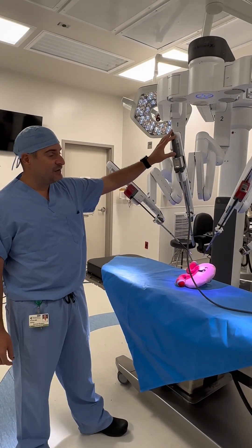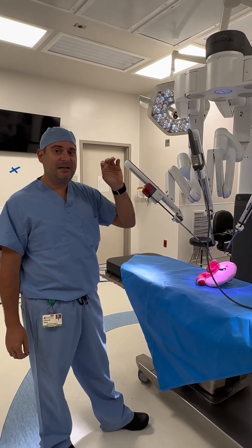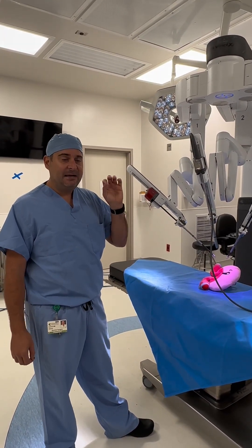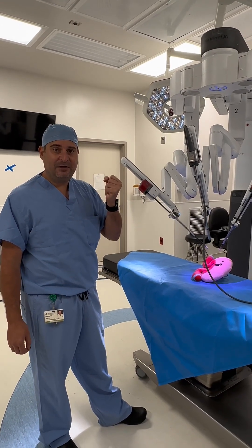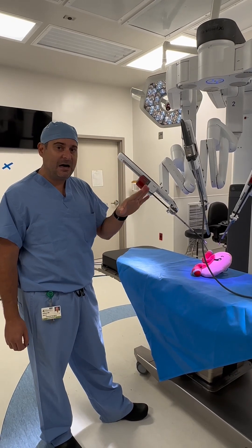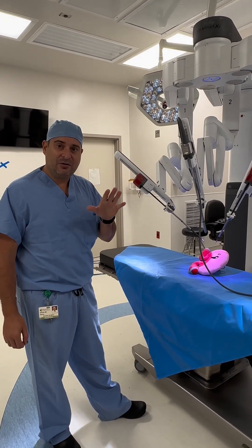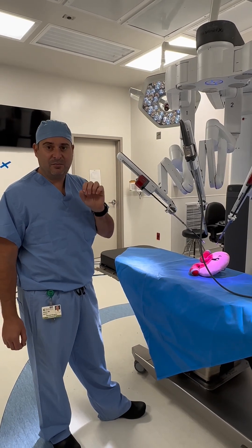This technology is amazing. When you talk about how these arms work, it takes the input from what I give it and assists me. It has about 10 times magnification, so I can see everything much clearer. Also, when surgeons operate, it can take away little tremors, so it makes my movements much more precise.